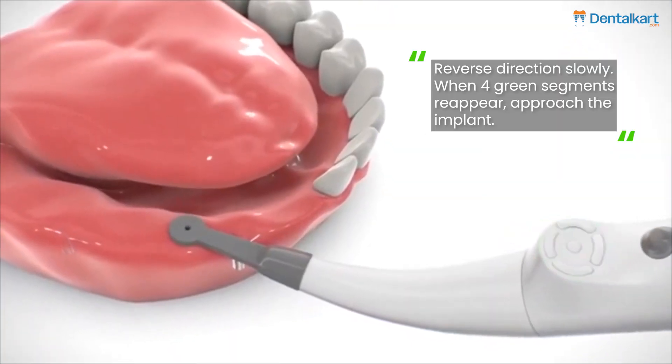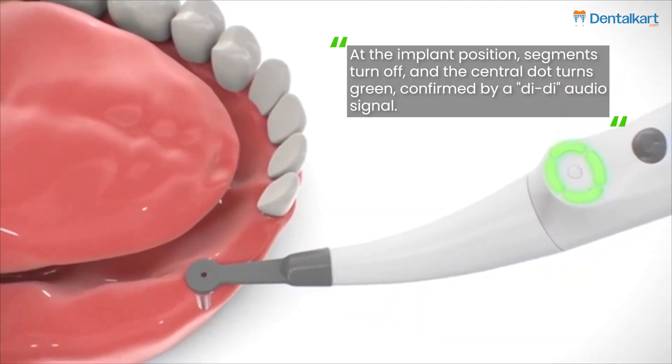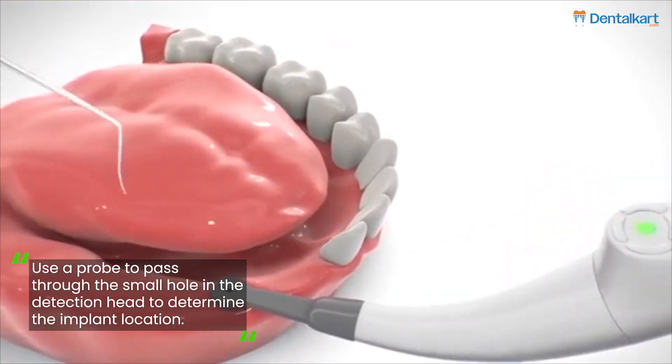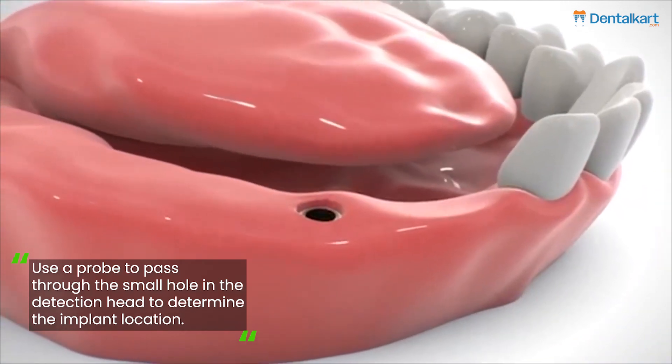Reverse direction slowly. When four green segments reappear, approach the implant. At the implant position, segments turn off and the central dot turns green, confirmed by an audio signal. Use a probe to pass through the small hole in the detection head to determine the implant location.